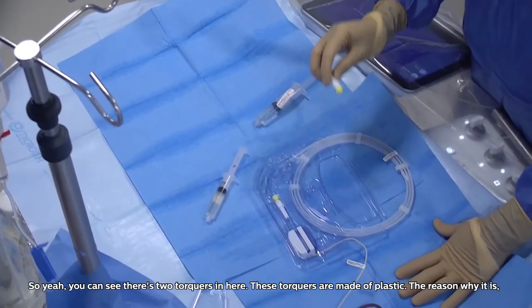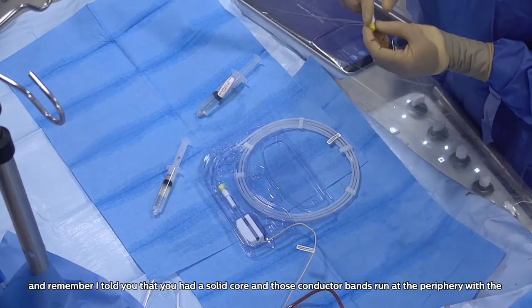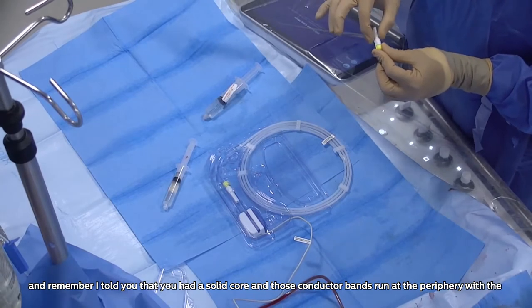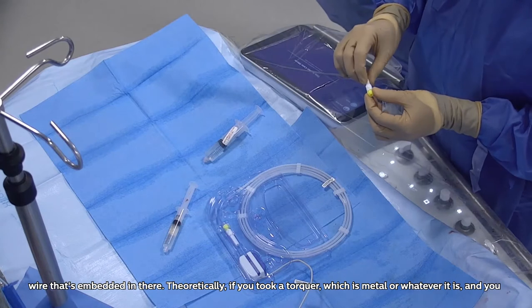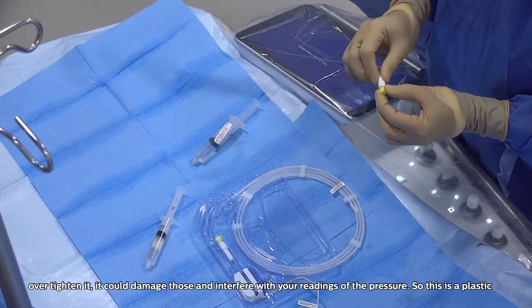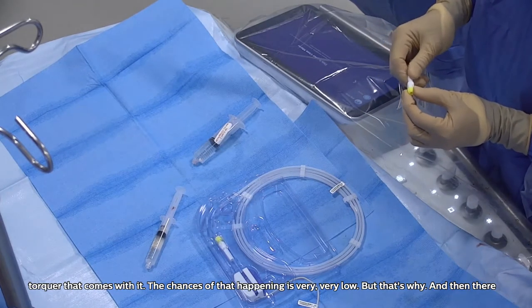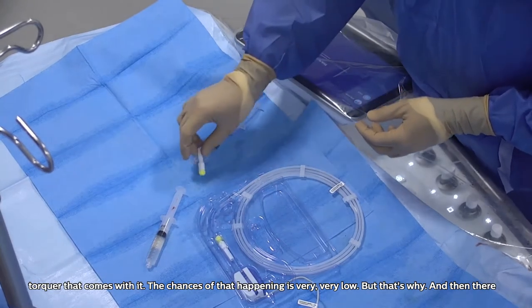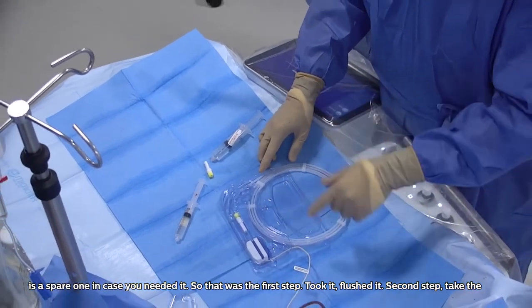So you can see there's two torquers in here. These torquers are made of plastic. The reason is, remember I told you that you have a solid core and those conductor bands run at the periphery of the wire that's embedded in there. Theoretically, if you took a torquer which is metal and over tightened it, it could damage those and interfere with your readings of the pressure. So this is a plastic torquer that comes with it. Chances of that happening are very, very low, but that's why, and then there is a spare one in case you needed it. So that was the first step, took it, flushed it.